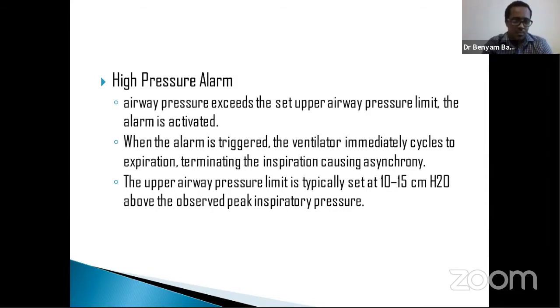Usually this alarm goes off whenever airway pressure exceeds the set upper airway pressure limit. So when we set the high pressure alarm, it should be above 35 or 40 centimeters of water. If the pressure exceeds that, then the alarm will go off.